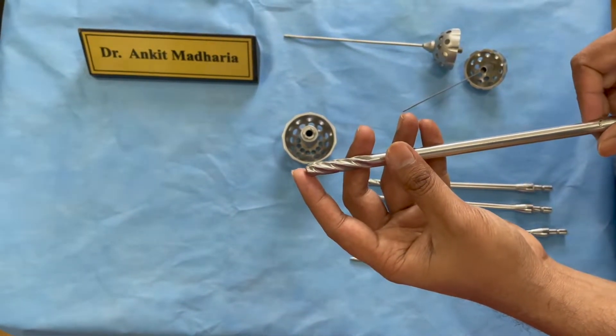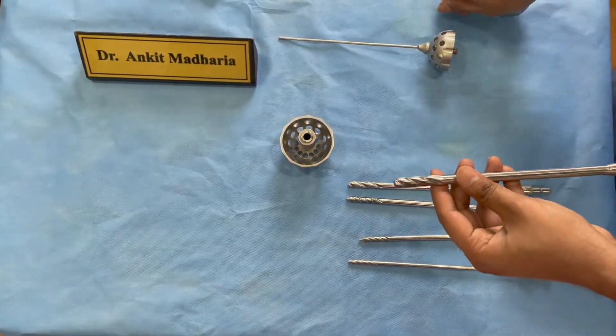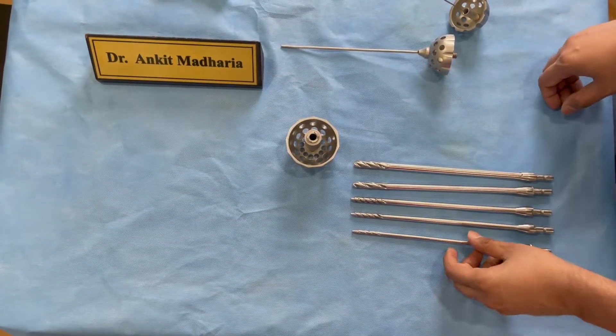These rimmers are used to remove the extra-articular part of the facet joint, or if the foramen is quite closed you can use them to open up the foramen before going in.